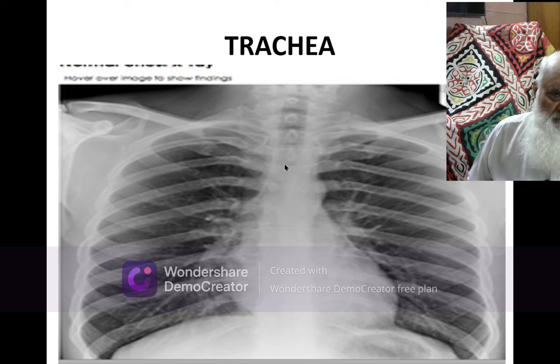Although there may be scoliosis in the thorax, no problem, but the trachea should be central, it should not be rotated, and the patient should be deeply inspired and hold the breath properly. These are the requirements as far as the PA view is concerned.